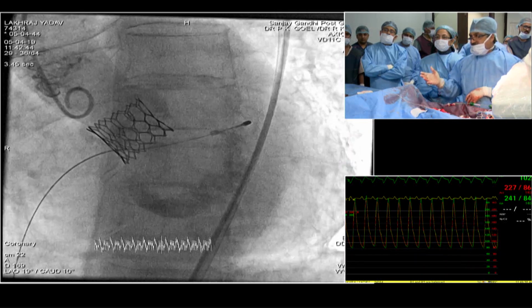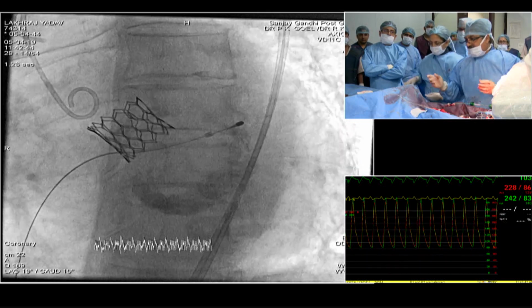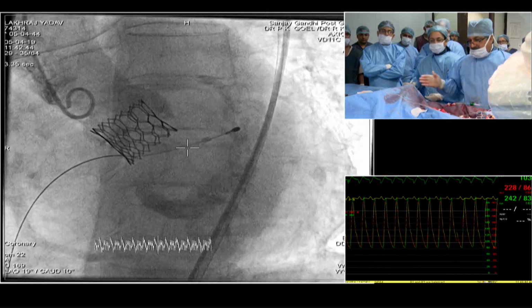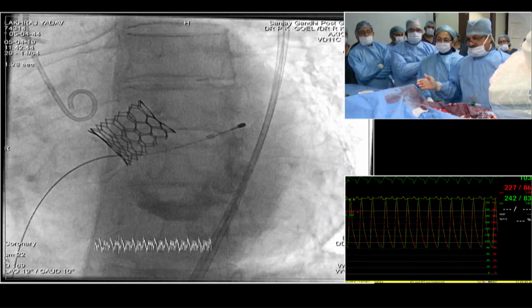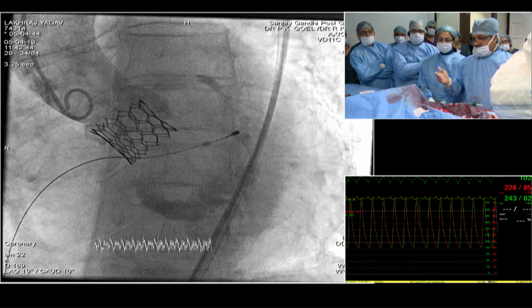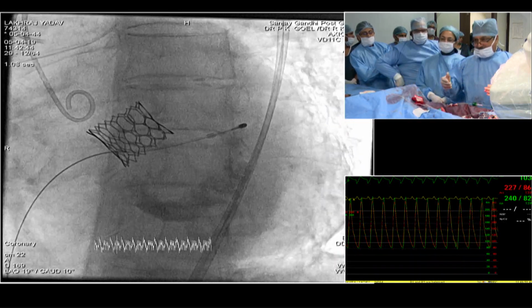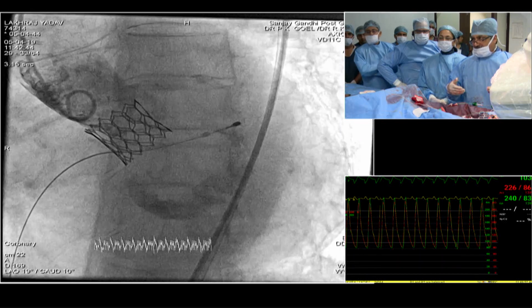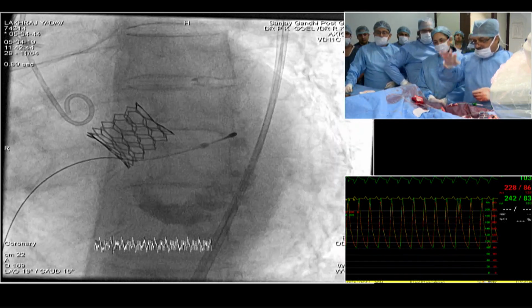The pressures are okay. And what I learned out of this was that with the wire in, we can't wait for 25 minutes that I had to wait, because I had crossed the valve just before getting live. And then, in spite of whatever happened, I thought they will come to us. You went outside somewhere.